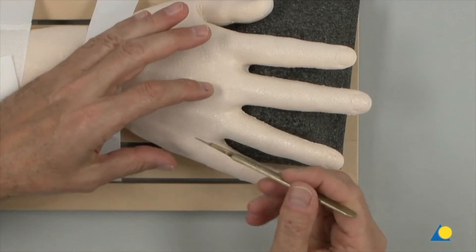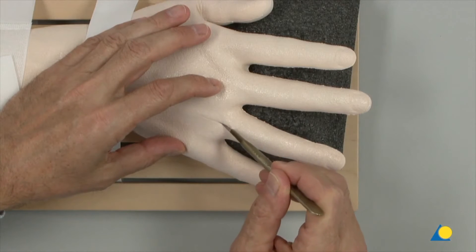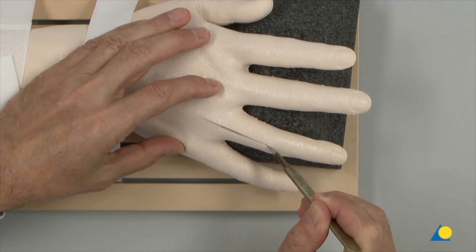Here, a straight longitudinal incision is made over the MCP joint and the proximal phalanx. A proximal curve over the MCP joint is also possible.